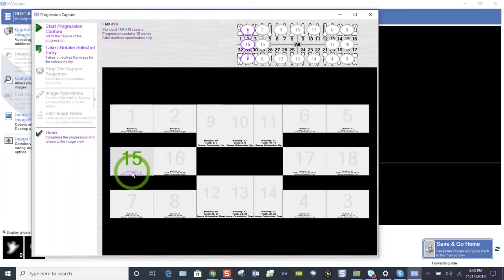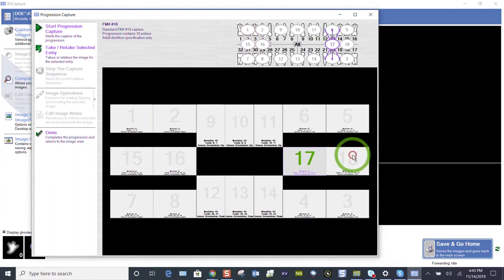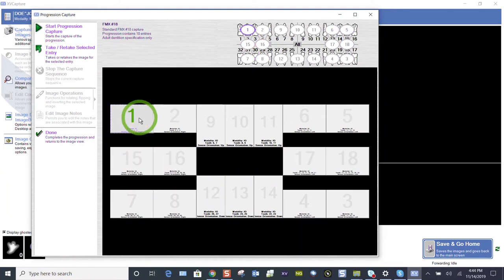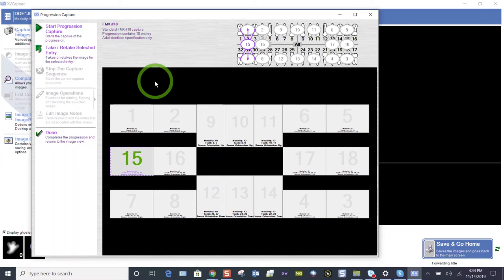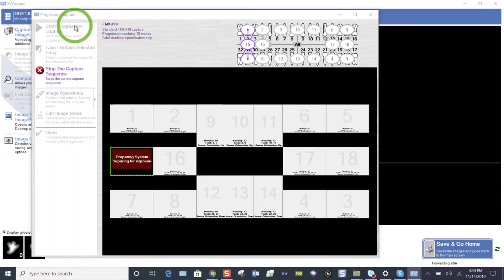It's going to move 15, 16, 17, and 18, and then start again at tile one. Let's just do that. Let's just take the bite wings first. Again, when we're ready to take images, the start progression, that progression is key. It's going to progress in numerical order through this layout. Let's hit start progression caption.